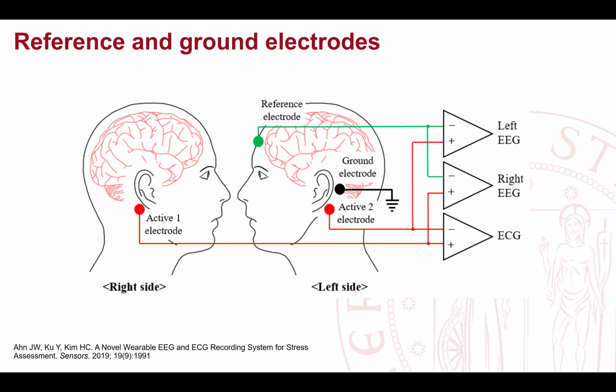But what you measure with the EEG is a potential difference. So it's the difference of the potential between two channels, one of which is a channel of the EEG system. The other one is the reference. So it normally is a neutral channel, which is generally placed, for example, on an earlobe. It may depend, because there is, for example, a company, Neuro, that has the reference in the top part here, in CPZ.